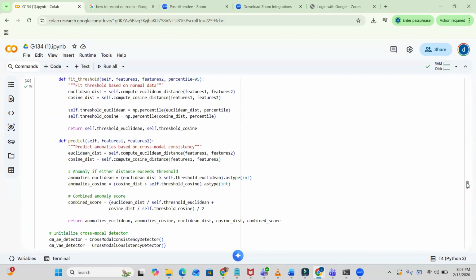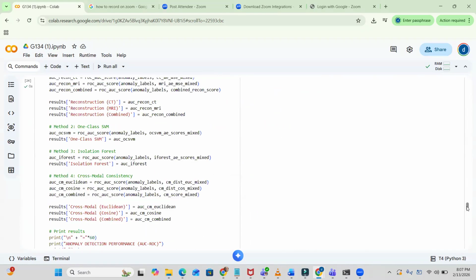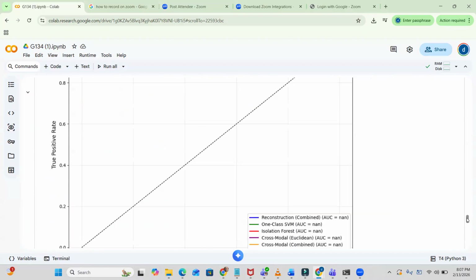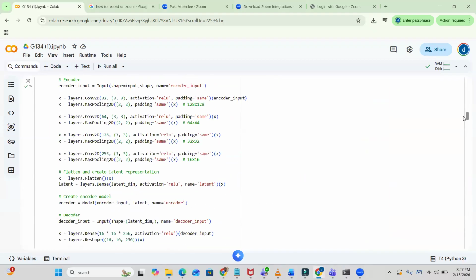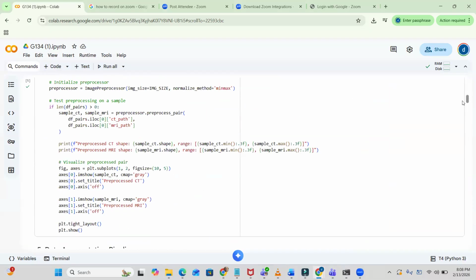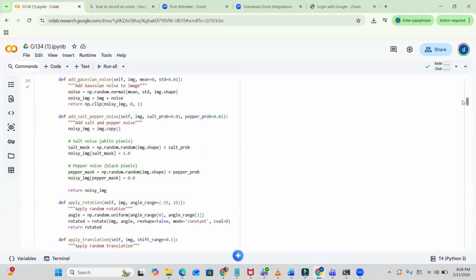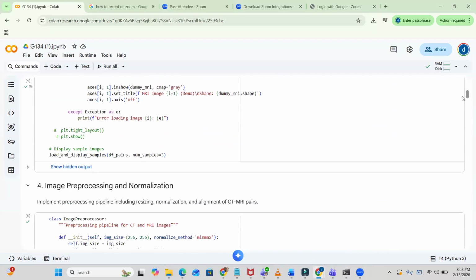And we will start with our parts. Jumping to my point, my name is Dilip Shukla, and I have developed an image pre-processing module that handles CT and MRI image normalization. As you know, there are different technologies. Speaking about the challenging part, CT scans and MRIs have completely different intensity ranges.